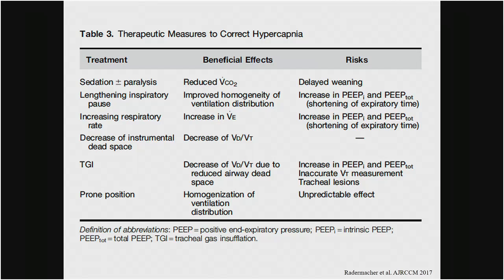And we always have to try to decrease dead space as much as possible, considering dead space not only the physiological, pathological dead space in the patient, but also the instrumental dead space that the patient is attached to when he's connected to a ventilator. Okay, so trying to get that as small as possible.